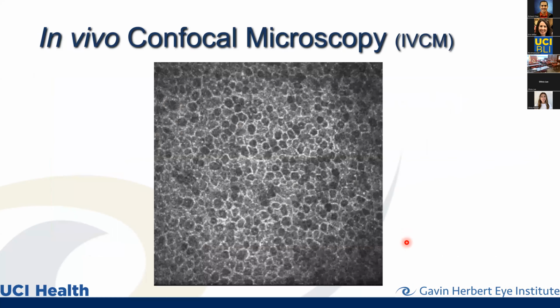And then this is what today's talk is about. In vivo confocal microscopy, which, again, I mentioned is typically done for another purpose, diagnosing infectious keratitis.